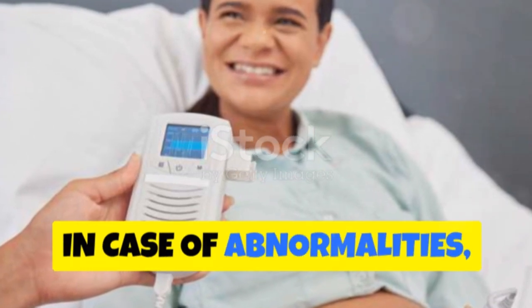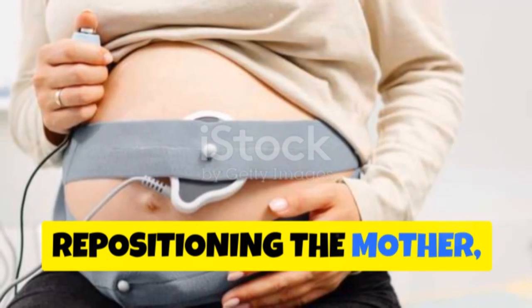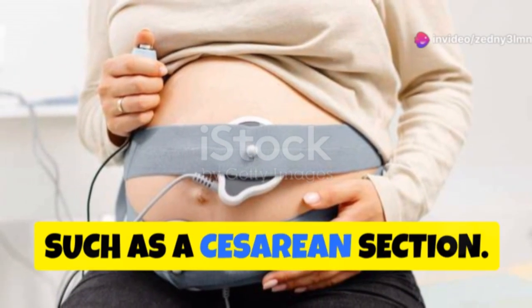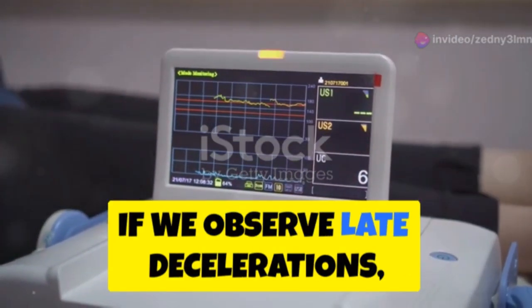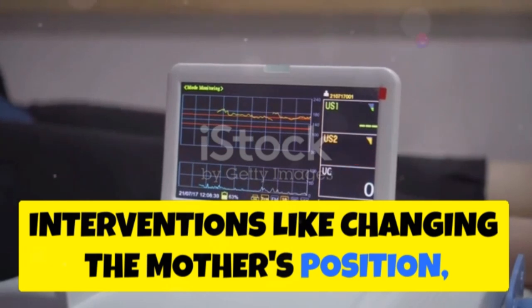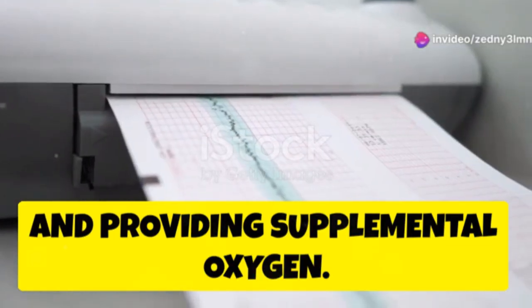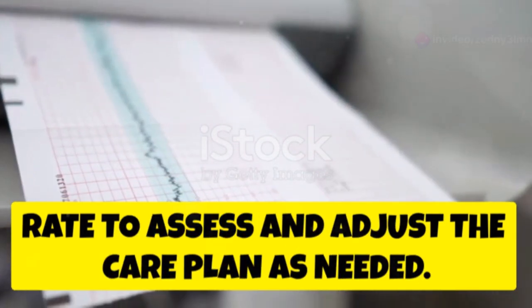In case of abnormalities, we implement necessary interventions, like repositioning the mother, administering oxygen, or preparing for potential procedures such as a cesarean section. For example, during labor, if we observe late decelerations, we notify the obstetrician and initiate interventions like changing the mother's position, increasing IV fluids, and providing supplemental oxygen. We then closely monitor the fetal heart rate to assess and adjust the care plan as needed.